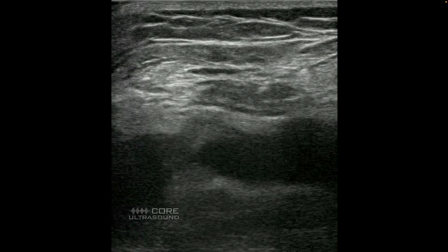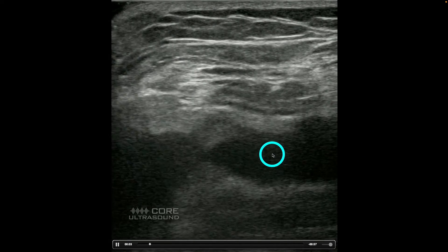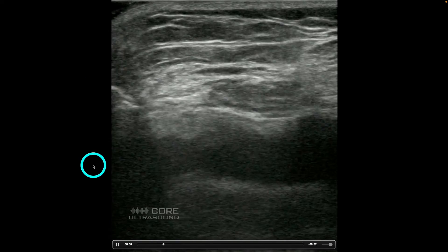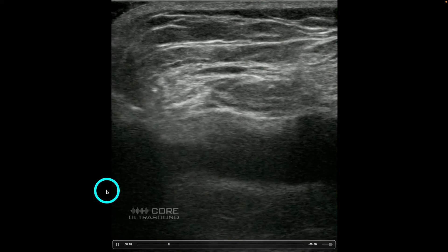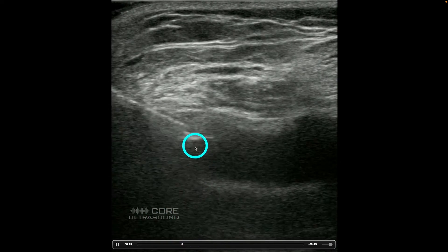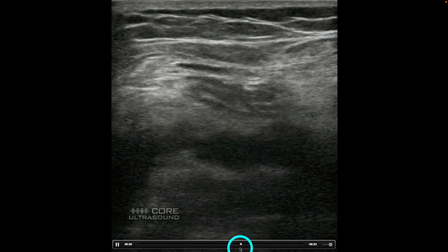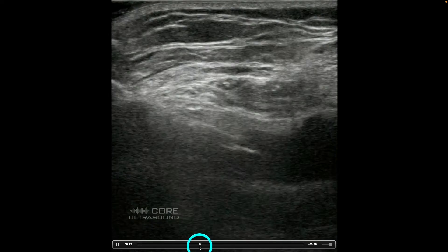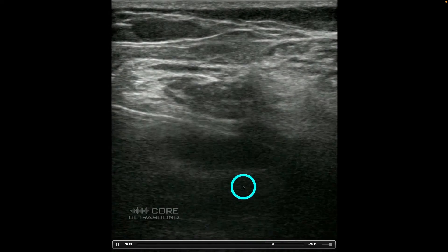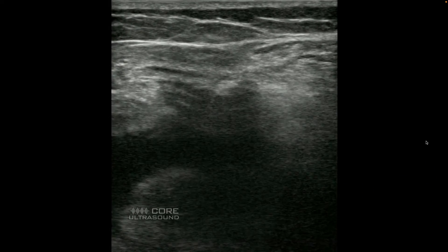Here is a slightly better example. You can see this pocket here — this is in the transverse orientation — and you'll be able to see my needle coming in on this side. I have a little better visualization because I have a 20 gauge spinal needle, so it's a little bit easier to see and manipulate. You can see me approaching that fluid pocket, and just as I enter there, there's a bit of height to that fluid. As I aspirate, you can see the height of that fluid actually diminish as I remove more of that knee effusion.